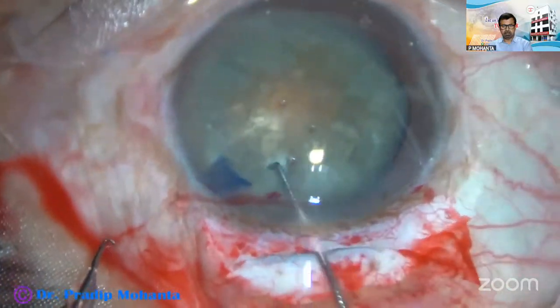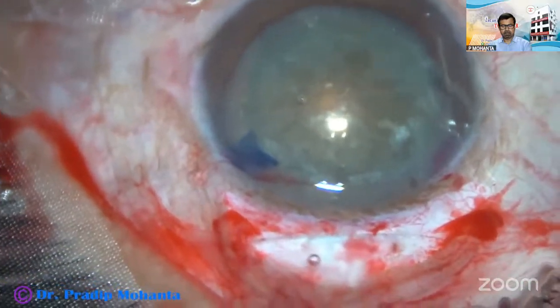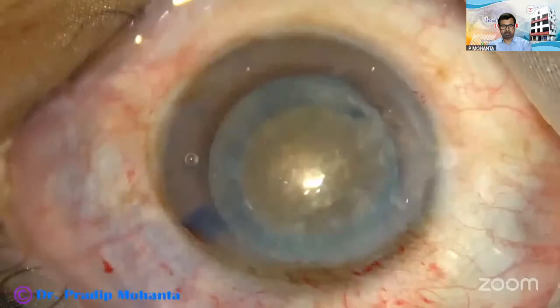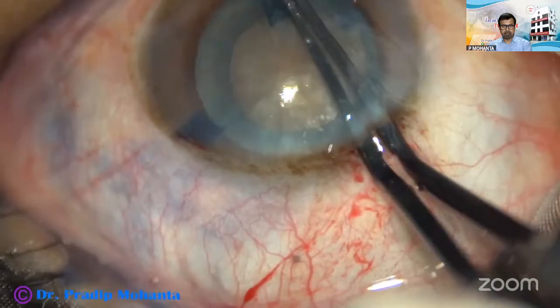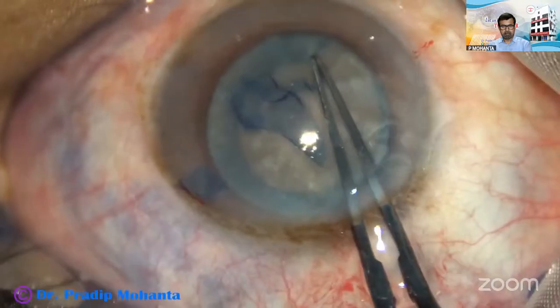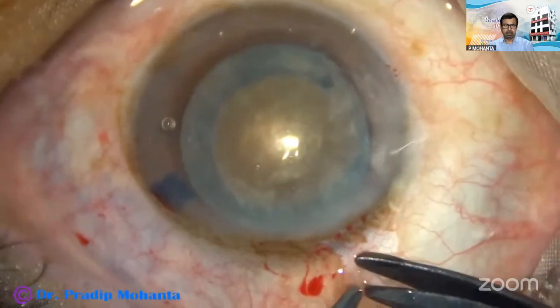The nucleus is prolapsed, the fish hook is taken, the fish hook is made by just bending a 30 gauge needle. It goes behind the lens, turns and hooks the nucleus out of the eye. This is another case, hard cataract. The cataract is grade 4 plus and rhexis was going nicely, but suddenly the rhexis runs out at 7 o'clock and it could not be retrieved. In this case also the right move is to convert to SICS.